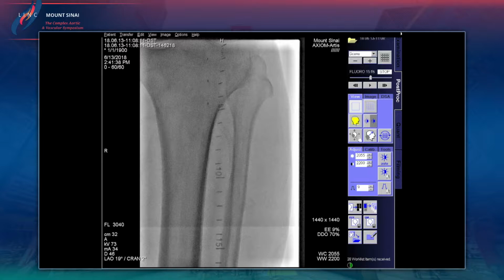I had a question for you. I don't know if I was hallucinating or not, but is there another stent down towards the ankle, or is it just this proximal one? I thought I saw something down towards the ankle. Is the DES proximally the only one, or is there another one further downstream? I actually have not seen that. When we get selective, let's take a look. They might be, as I said, he has had work done before. I also have the impression that I saw one down near the ankle. I think there's one though.